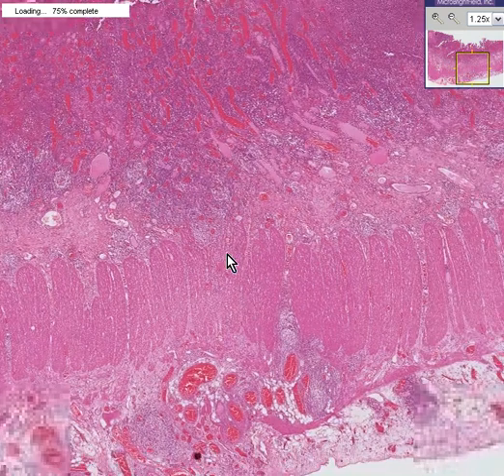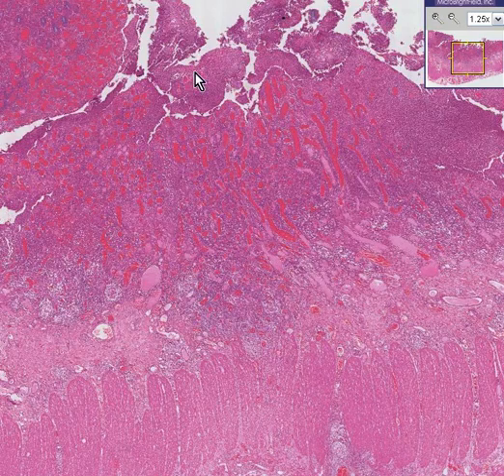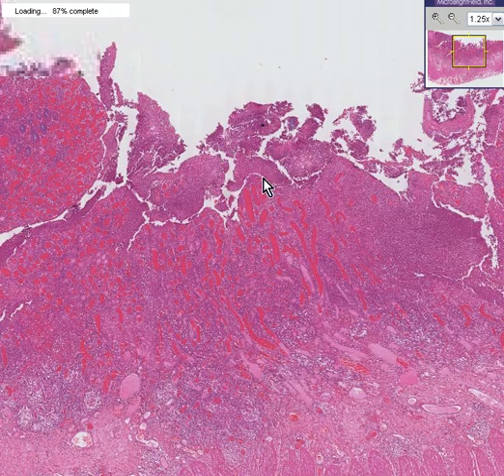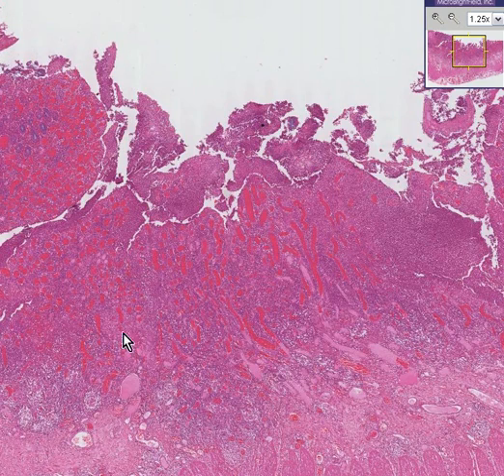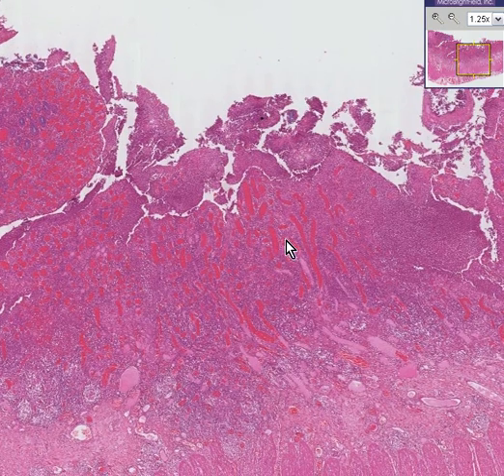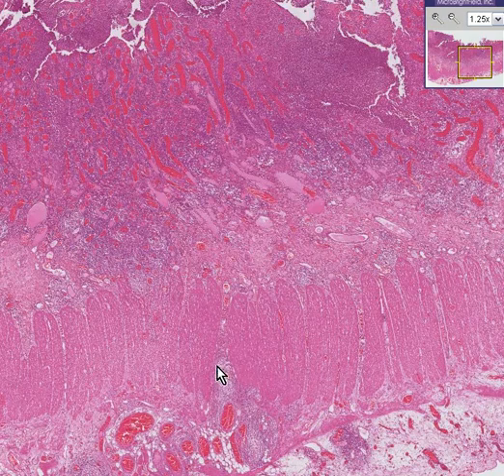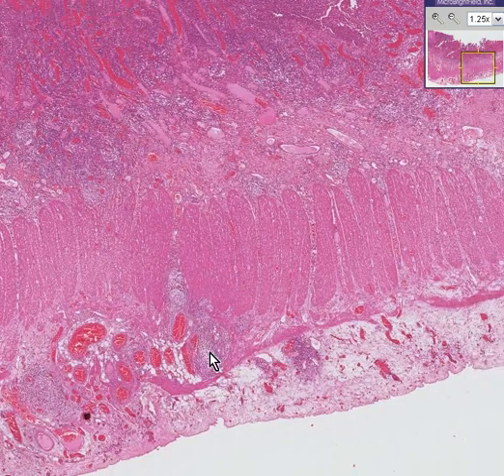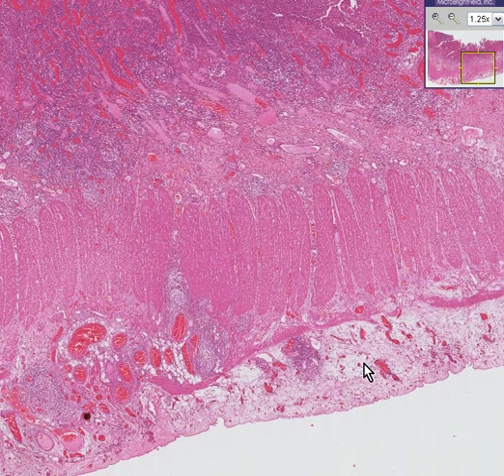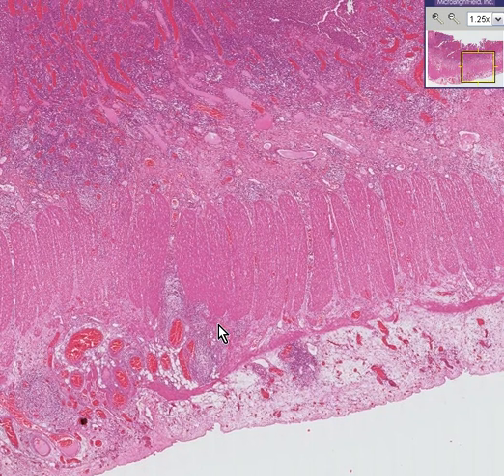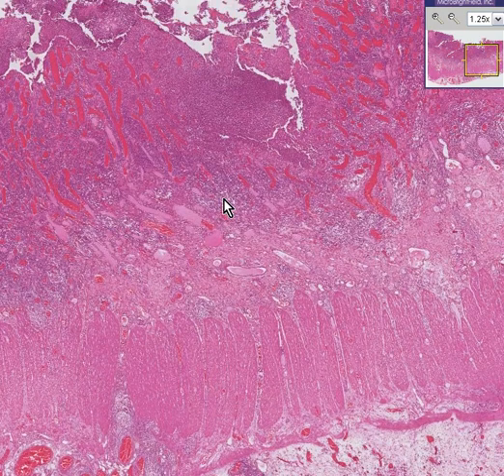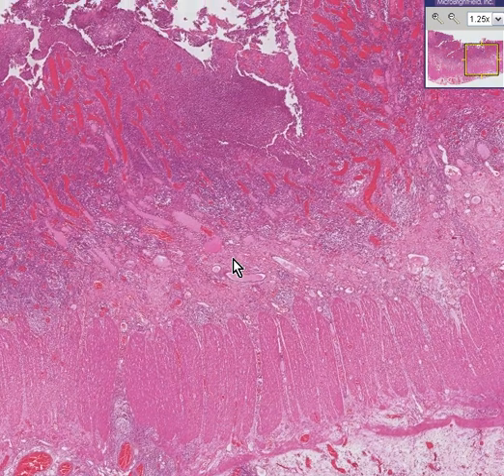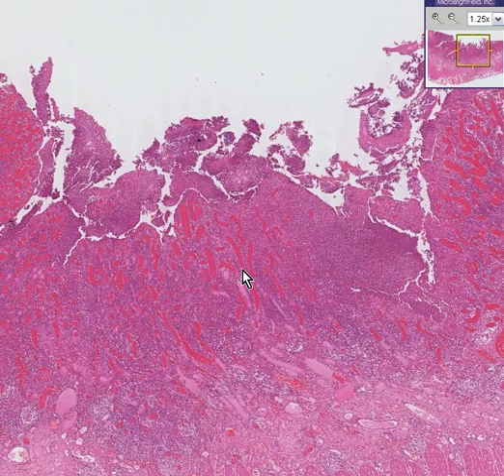You can see that there is inflammation very extensively throughout the mucosa and the submucosa, and we'll even find some inflammatory cells there in the muscularis, as well as in the serosa, which is extensively infiltrated as well. So this is a pan full-thickness small bowel inflammation.